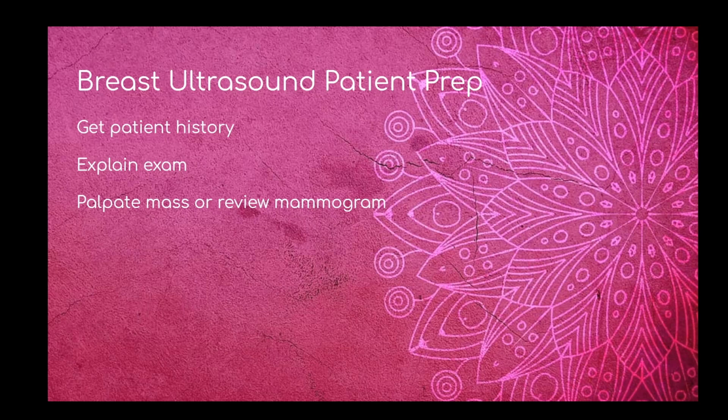And it ended up being this whole line of just kind of a fibrous band, a really prominent Cooper's ligament. And it just kind of moved around with her positioning, and it really just felt like it extended through the whole breast. So that really helped us to kind of move away from, are we looking for a very particular pinpointed spot, or can we hedge our bets on this? This probably isn't cancer because now we've found this Cooper's ligament that corresponds with what you're feeling. So make sure that you are palpating the mass, feeling the mass that they're feeling, so you can have a better idea what you're scanning, and then can relate that back to the radiologist.